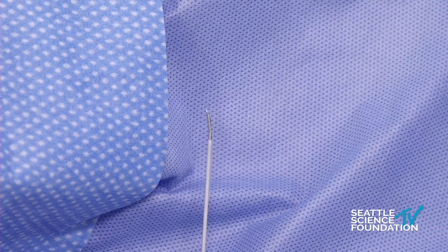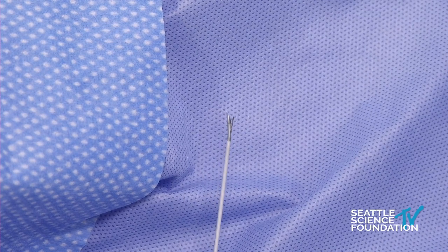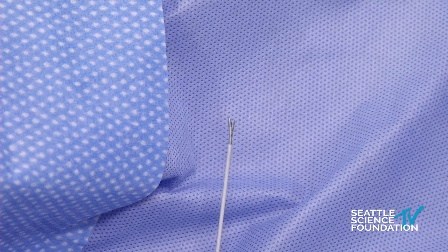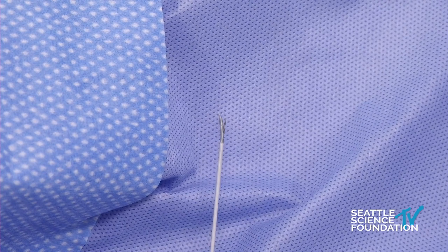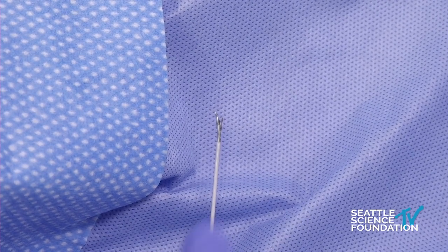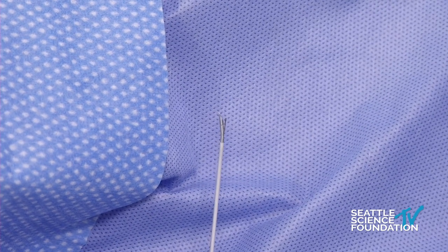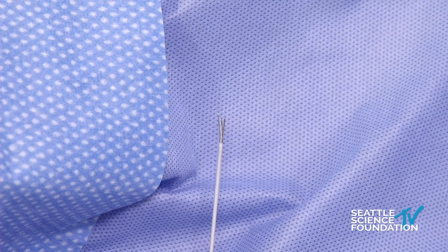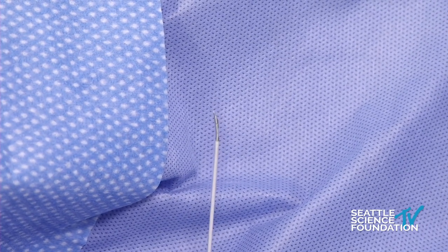So a Sidekick needle is unique because it has this aperture on the side that allows for the stylet to exit in a forked pattern, and the result is that you get a lesion that surrounds both of these spaces, and the lesion will therefore be quite a lot larger. It approaches twice the volume of a lesion that would be produced by the single cannula alone.